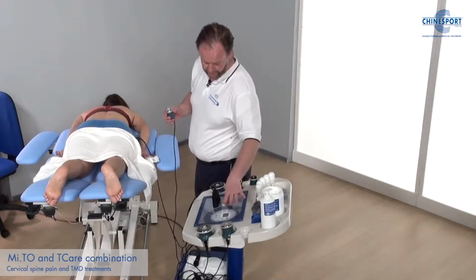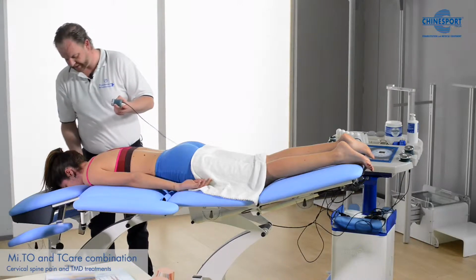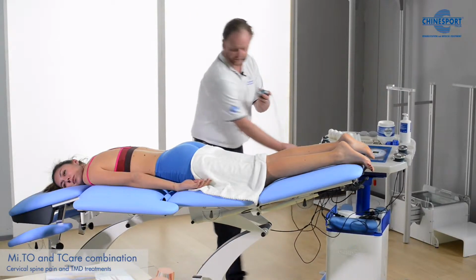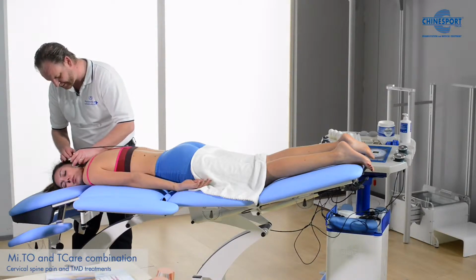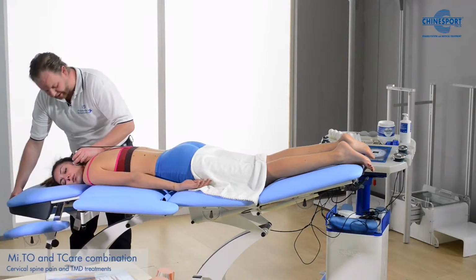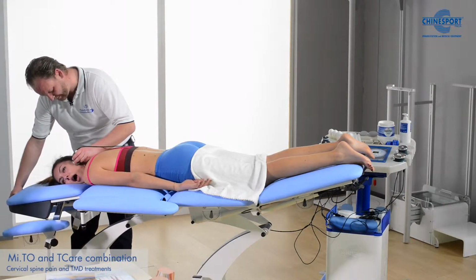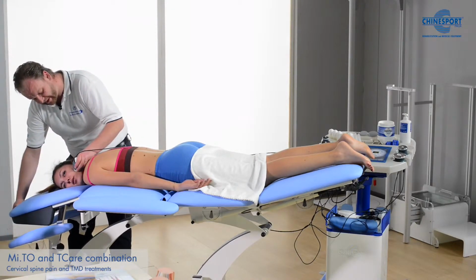We reduce a little bit the energy settings. Yep, and you can turn around. Yeah, and we can simply work on the temporomandibular joint here using our movements, but also combining mouth opening and closing. And we can move over the masseter.